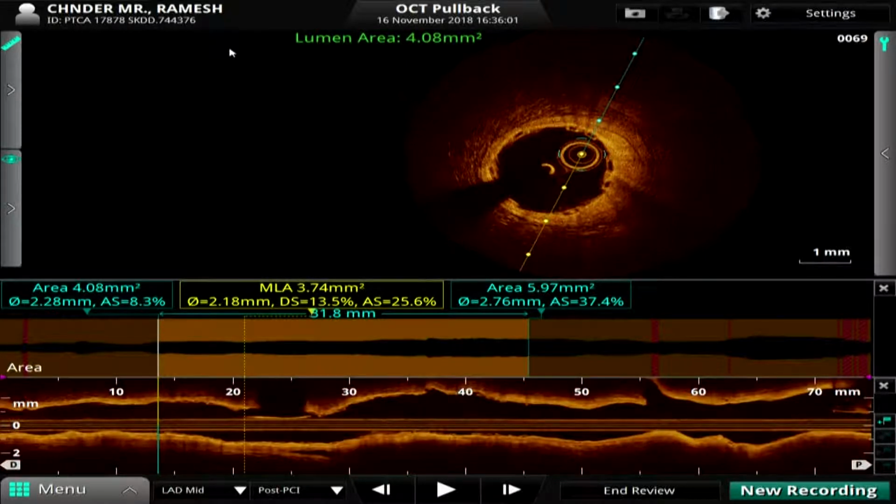Yeah, so I think that's a very good point. We should do a post stenting FFR and see how it goes. Can we get the FFR wire and adenosine, please? Yeah, I think that's a great idea. It's a great idea. I would do that.